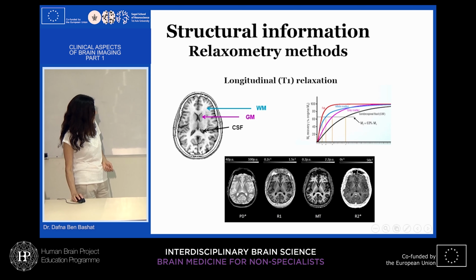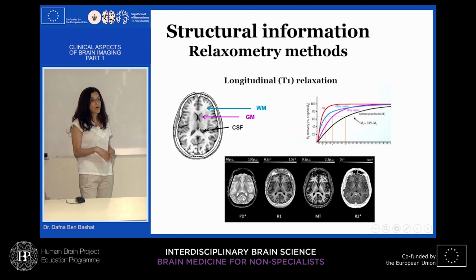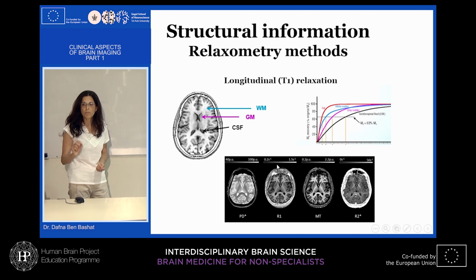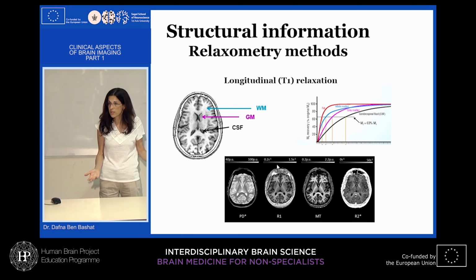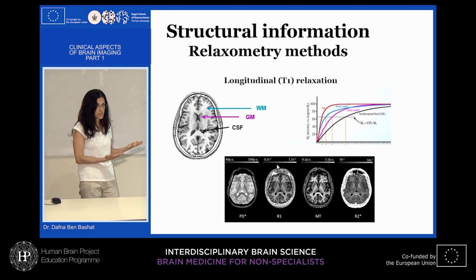A lot of effort is now being made by all the MRI vendors to have one sequence, what they call MR fingerprinting, where in one sequence we can get this information, not anymore T1 weighted. It's like having two children, one taller than the other. I tell you the difference is 20 centimeters between them, but you don't know where they absolutely stand.